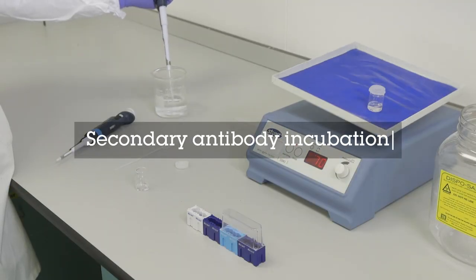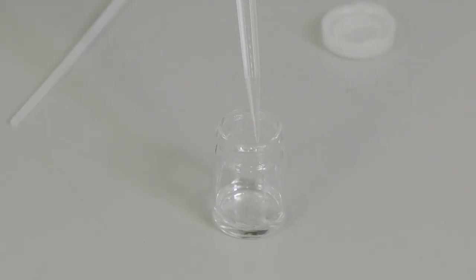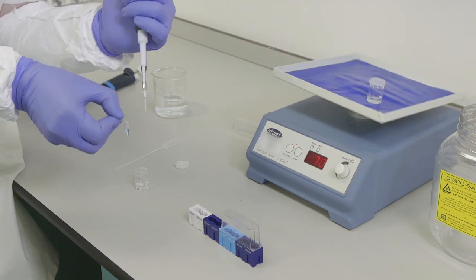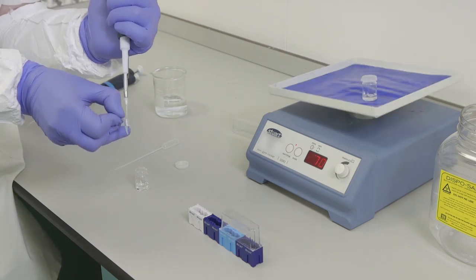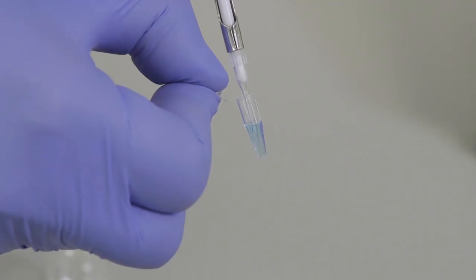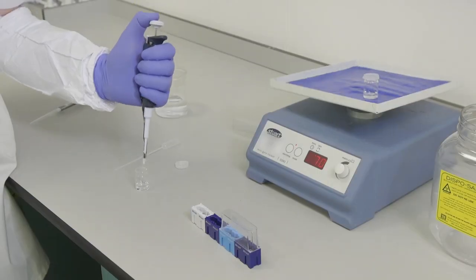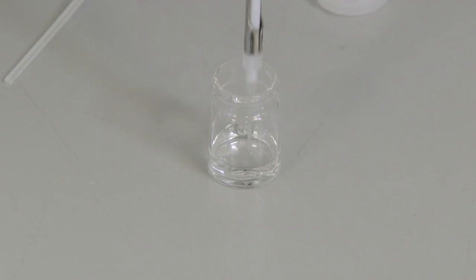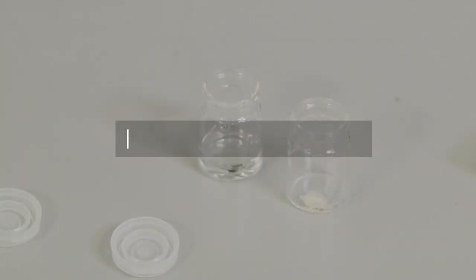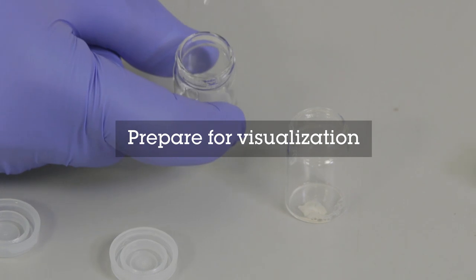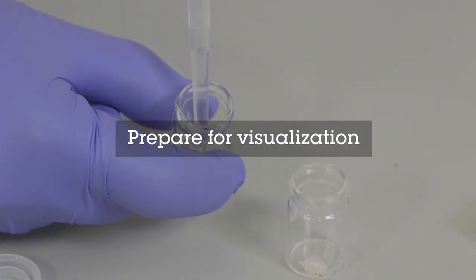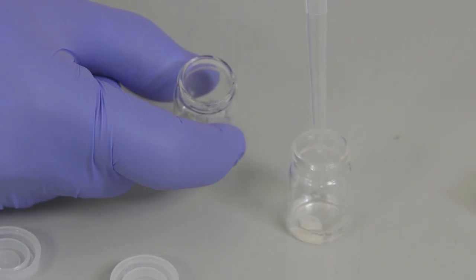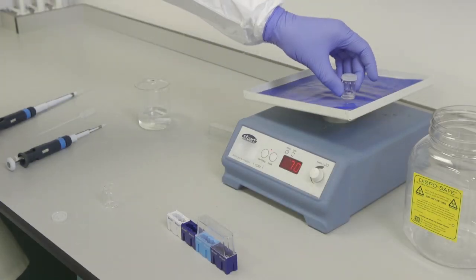Prepare the secondary antibody solution by diluting the secondary antibody in the Tris Triton solution to the correct dilution factor. A good starting point is the guideline provided by Abcam with the product, but it is recommended to optimize this for each antibody used. Here we are using a secondary that is conjugated with AlexaFloor 647. Remove the wash solution and add the secondary antibody solution to the brain slice, leaving it to incubate at room temperature for 1 hour.